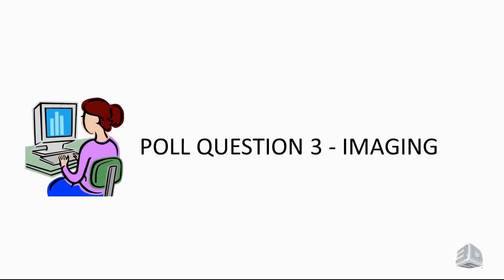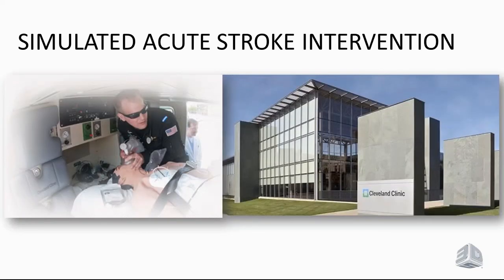And we're not using CT alone. The only case where we might do that is in a patient who was picked up by the truck. You saw that there was a large vessel thrombus, like a hyperdense M1, and you've got the patient in the first hour. They're young, they've got a high NIH stroke score. We may just take them to the angio suite. But virtually everybody else gets CT, CTA, and if there's any question about how big the core is, we get an immediate MR as well.